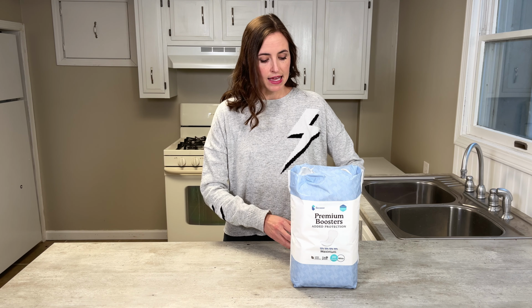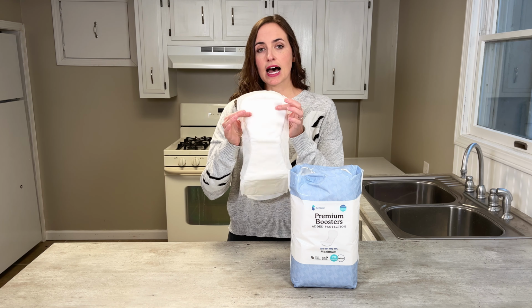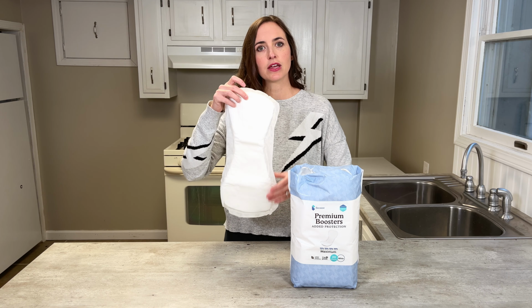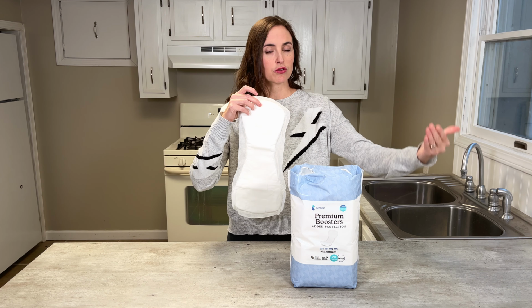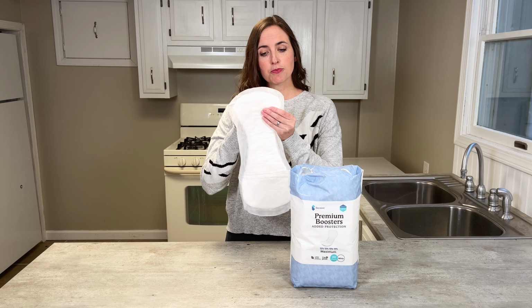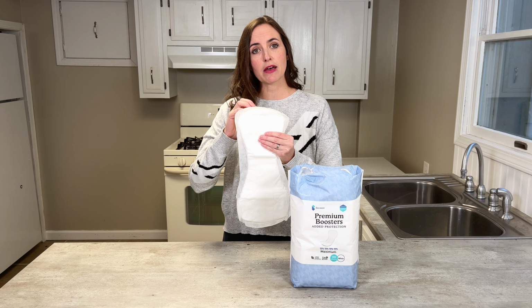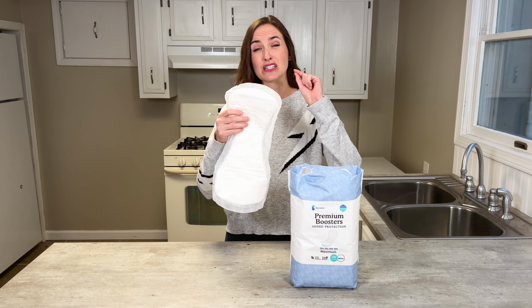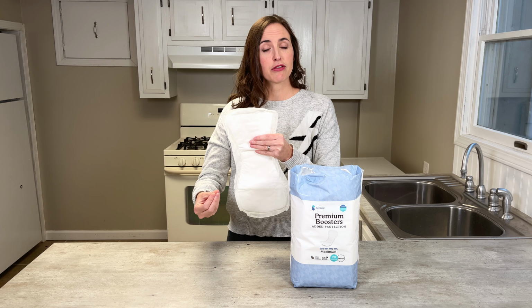And the reason being is that a booster pad has what's called flow-through technology. So the backing on it is not waterproof. And why this is important is if you're wearing a regular pad, it has the waterproof backing to stop the liquid from going through to the underwear or pants or surface that you might be sitting on. However, it has a limit to how much capacity it has. The booster pad does not have that waterproof backing, and therefore the liquid will go through it eventually once it's reached its maximum capacity, which in this case for these booster pads is 4 cups of added absorbency. It will go through the pad and into the pad underneath it, into the brief.